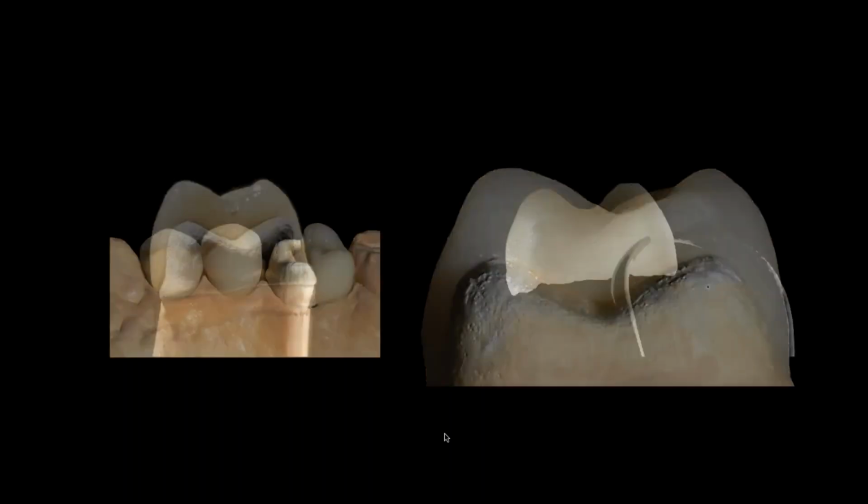Okay, so now if you start to look at the coloration here, you look at the difference and how that really works, right? Look at the color that's actually shooting up inside the tooth. And you can see that this is all coming from internal, not from the outside. So this is where when we talk about staining, glaze can look beautiful. It can, but can it look as beautiful as this? Definitely not. The color comes from the inside, and that's where the light and the value comes from.